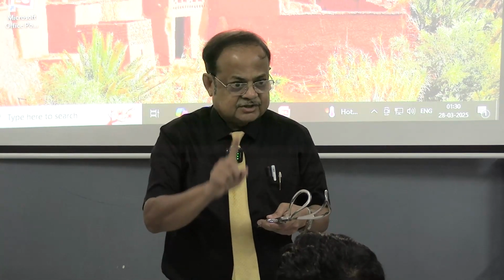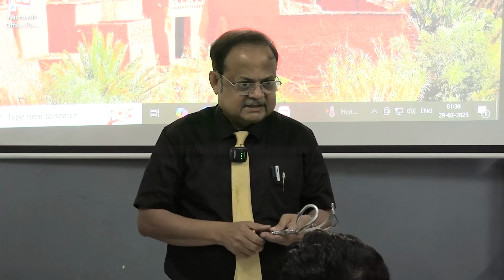One is the obstetric forceps. I will be asked in exam, what is this?